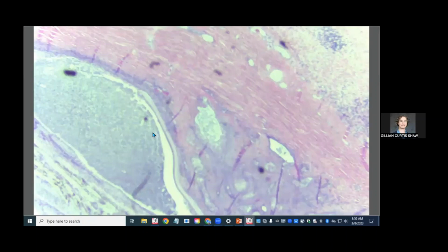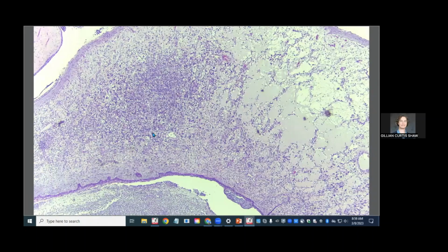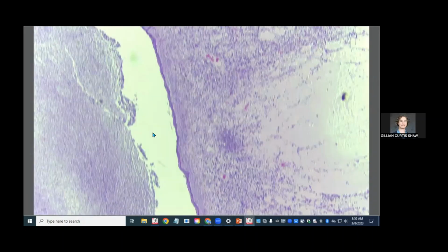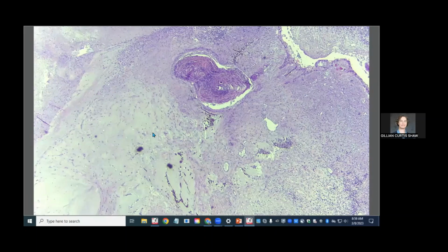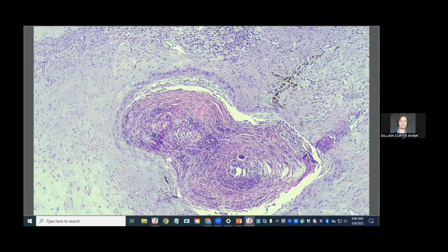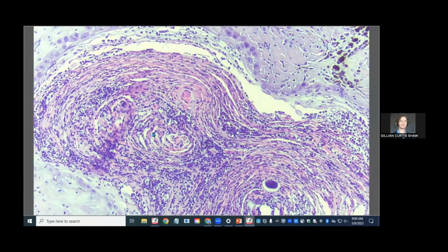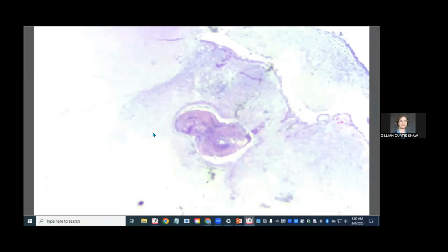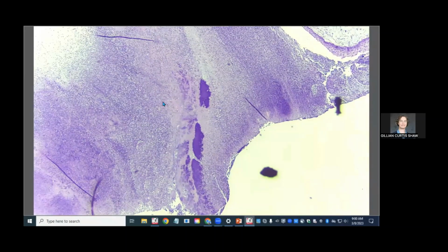And then within one of the iris leaflets, here's our iris coated by neoplastic epithelium. Over in this iris leaflet, one of these islands of cells is just making oceans of keratin, which are mixed with a bunch of neutrophils and cellular debris. There are also some really large bacterial colonies present. These oceans of solid dark blue, that's all bacteria, which is just opportunistically colonizing this open space.